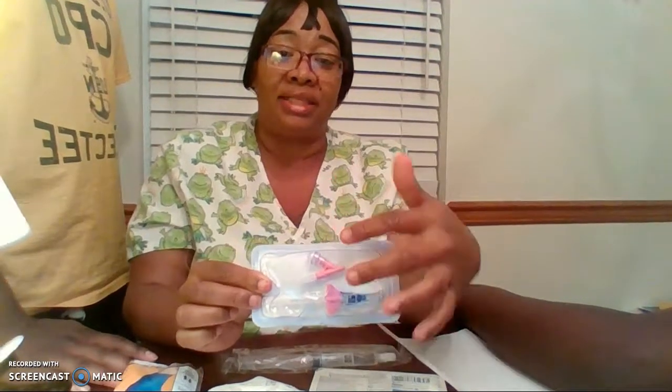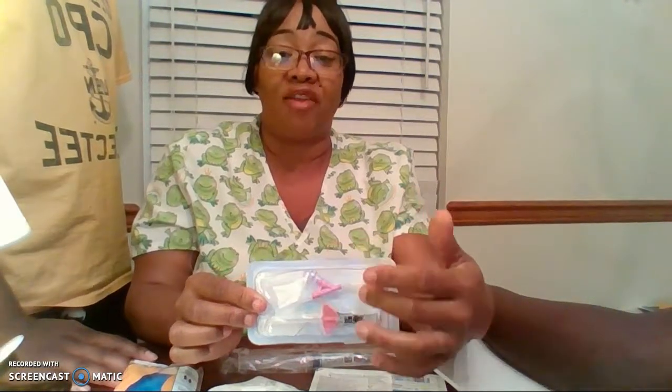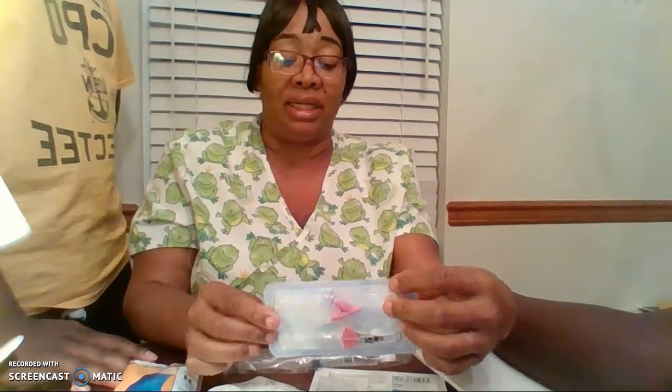So where I work, we use these 20 gauge angiocaths, and they have a connection catheter to it that has a double port, and we can use this port when we are starting the line to draw labs. We can also use the multiple ports for different things, so the patient may have blood running in one and IV fluids running in the other, or they may have something running in one and the other one just there to add medication to the line as the fluids are running simultaneously.